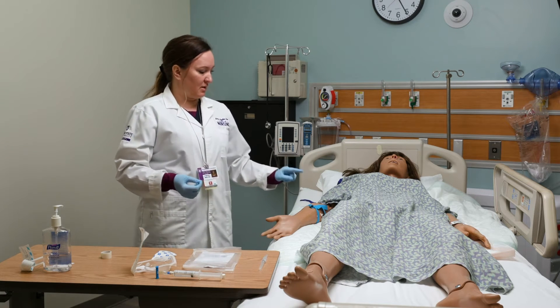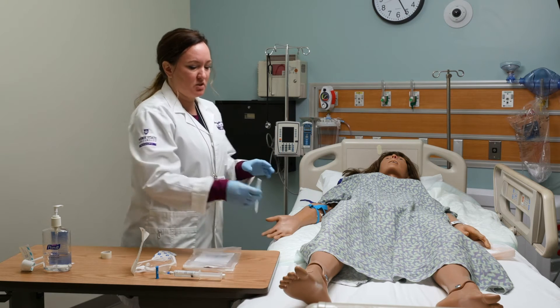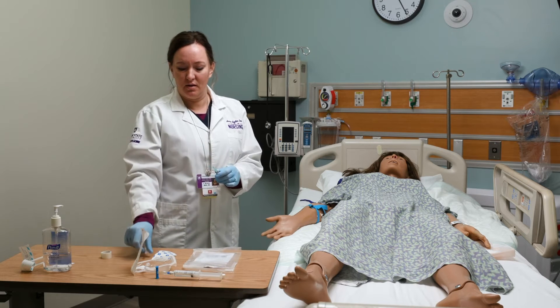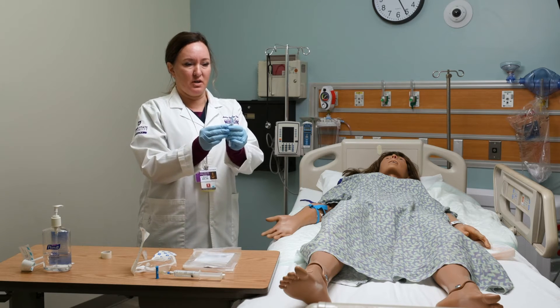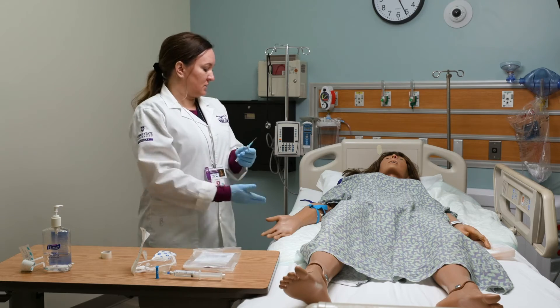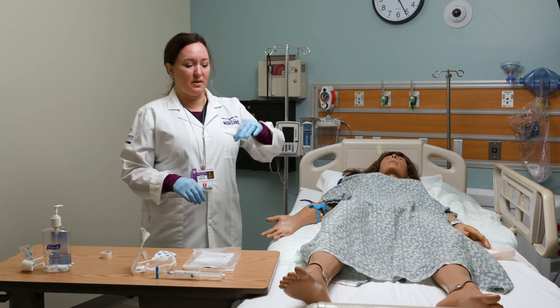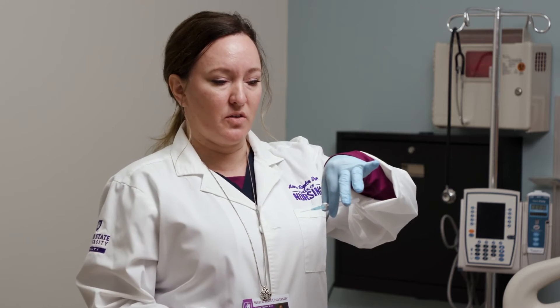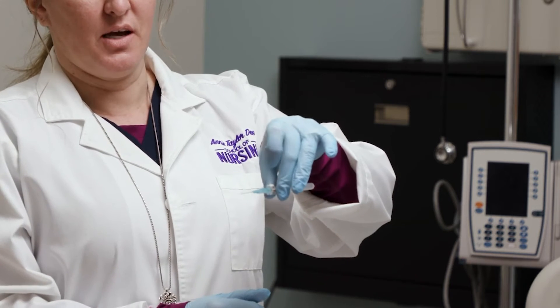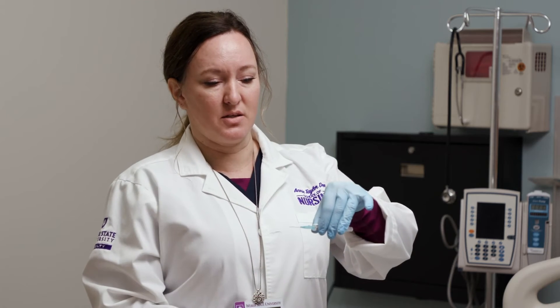Keep in mind that you only have two minutes to leave your tourniquet on. This is a good time to talk with the patient or get out your needle and take a look at it to make sure the catheter doesn't look sheared and everything looks fine. Once you've let the skin dry for 30 seconds, you're ready to start the IV. You can hold it with your thumb and pointer finger or with your thumb and middle finger, and use your pointer finger to thread the catheter — either way is a good technique.